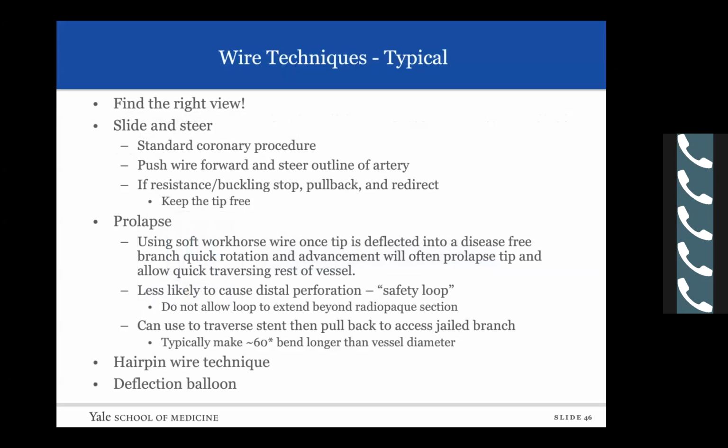So wiring techniques, there's really two common techniques for wiring coronaries that are open. Slide and steer is basically pushing the wire forward and steering based on your outline of the artery. If you find buckling or resistance, you stop, pull back, redirect. The key with this is to keep the tip free and minimize the buckling. If you're buckling, you're digging into the side of the vessel, and that's when you will have dissections, unless that's your desired outcome.